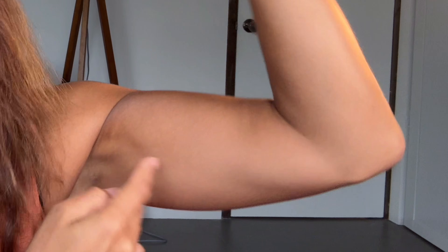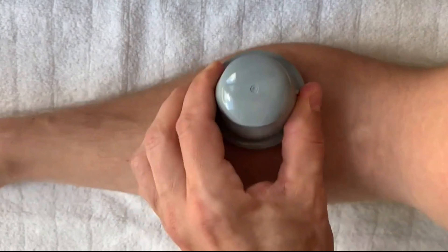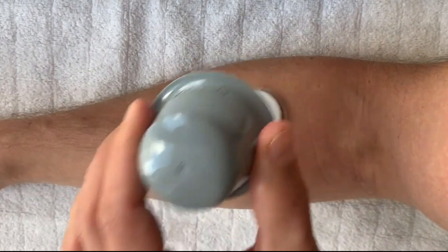Another Libre placement that earns high praise online is the inside of the arm — again, not a place I have a lot of fat, but maybe you don't need it. And then there's the forearm, which I also haven't built up the nerve to try. I've seen other people wear their CGMs there and really like it — for example, my friend Connie wears a different sensor in her forearm. Some feedback on this placement from others on YouTube is that it can really hurt, and you might get delayed readings, probably due to lower blood flow in that area.